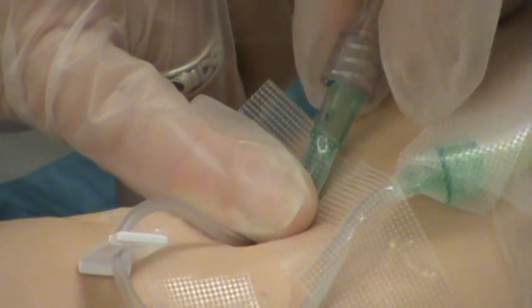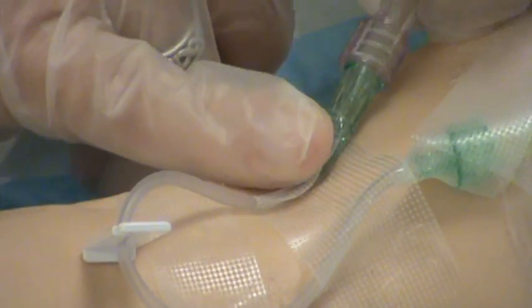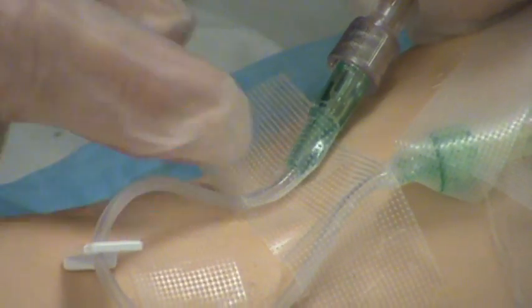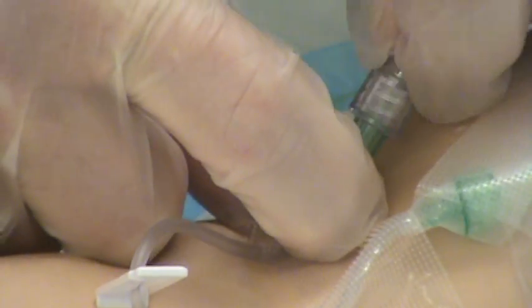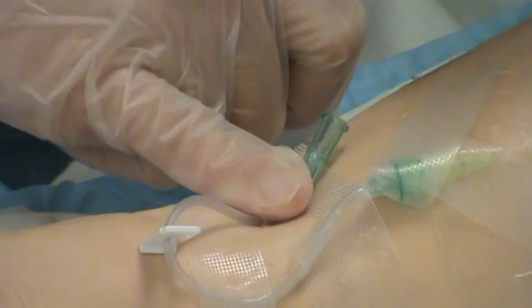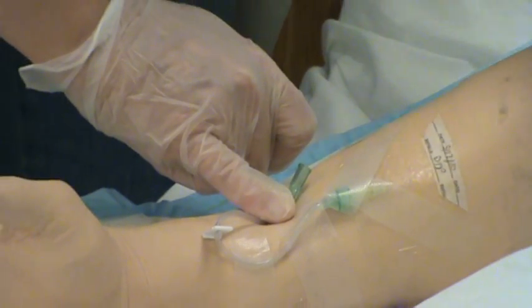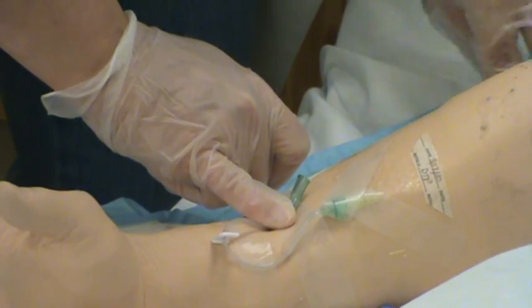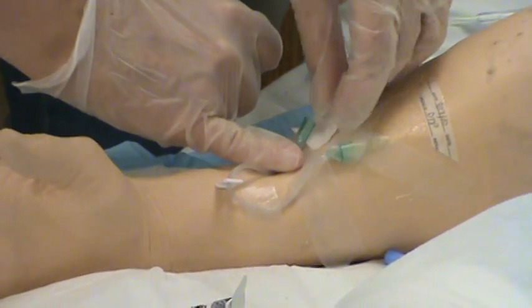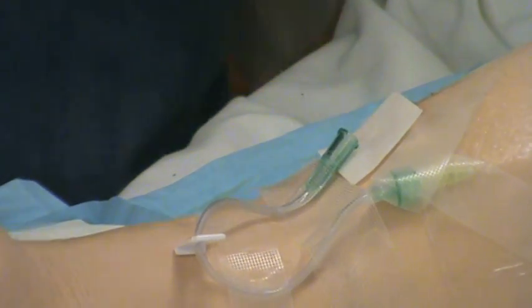Putting my pressure on that, even though I really don't need to because of the fact that I've got it clamped, but I want to be careful. I'm going to have to obscure your view for a second while I take hold of this. Okay, I loosened it. Now I can do this. This comes out. I've clamped it so I don't have to be worried that this is going to drip all over anything. I can simply lay it on my blue pad, and I can take my little sterile field of an alcohol swab and lay that there while I get the new system ready to put on.